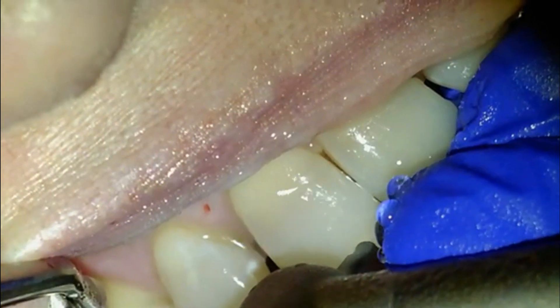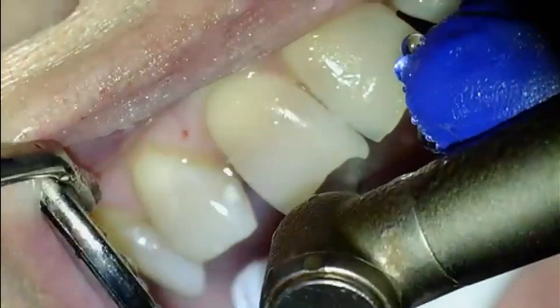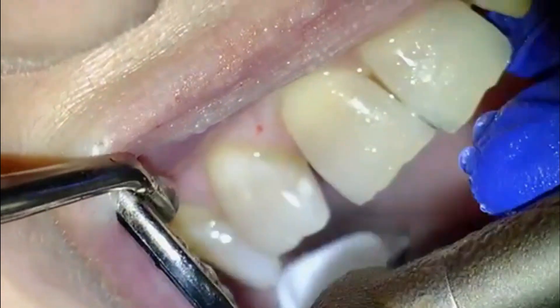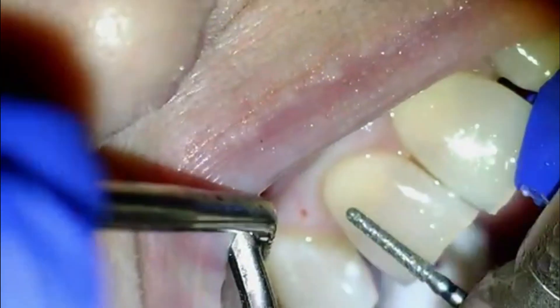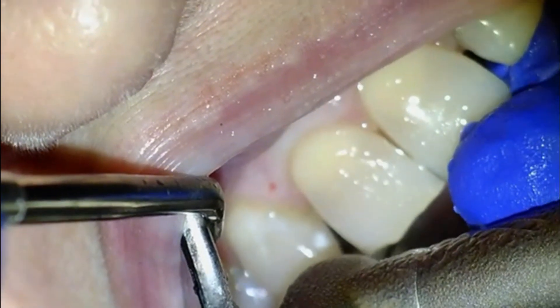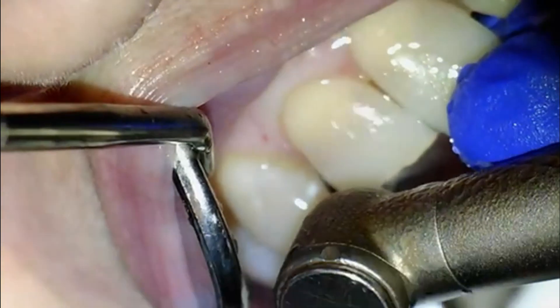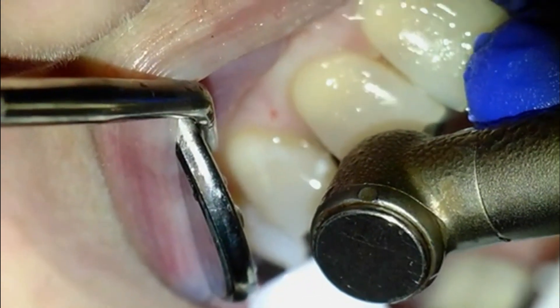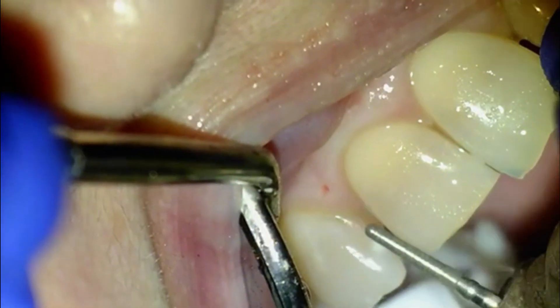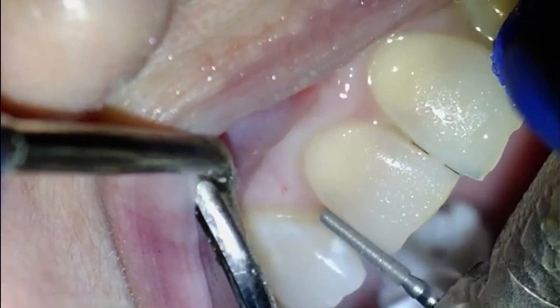However, we have requested that the lab hand polish these instead of glazing. If you take the time — and it's a very meticulous process — to hand polish zirconia to a glass finish, then the polish is such that the teeth actually do not wear against them. This comes with a further cost from the lab, but it is the right thing to do and overall better for the patient. The reason we are using zirconia is that I cannot get enough structure removed to place something like an Emax or a lithium silicate, so zirconia is the strongest and best option.